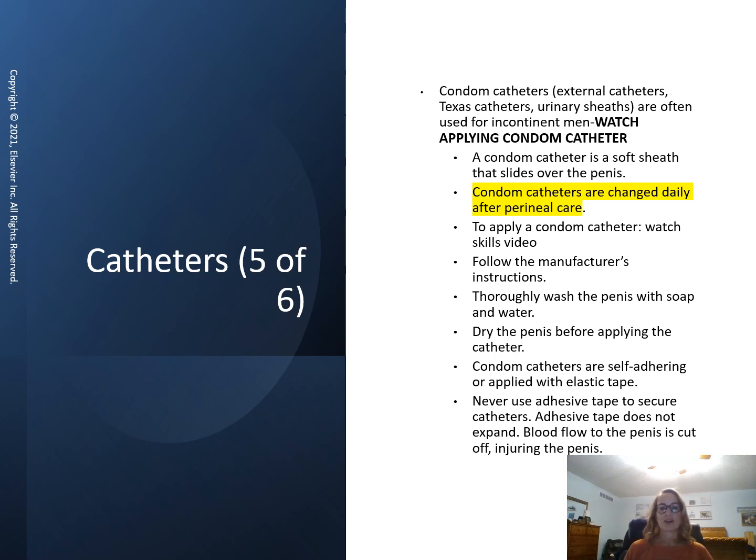Condom catheters are self-adhering or applied with elastic tape. Never use adhesive tape to secure the catheter. Adhesive tape does not expand, and blood flow to the penis will be cut off, and that could injure the penis. Okay?